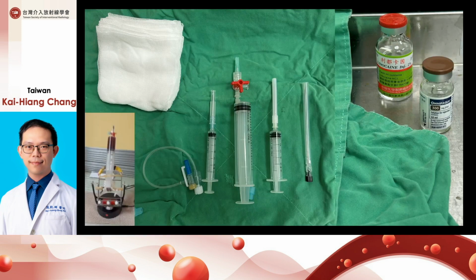This is our setup. As you can see, it's very simple. The only thing you need is a 25 milliliter syringe connected to a three-way switch, a connecting tube, local anesthesia, and contrast medium that is indicated for myelography. In our hospital, we use Omnipaque 300. Our leading tool is a 22 gauge spinal needle. And on the left side is a tube shaker. This device is a prototype.